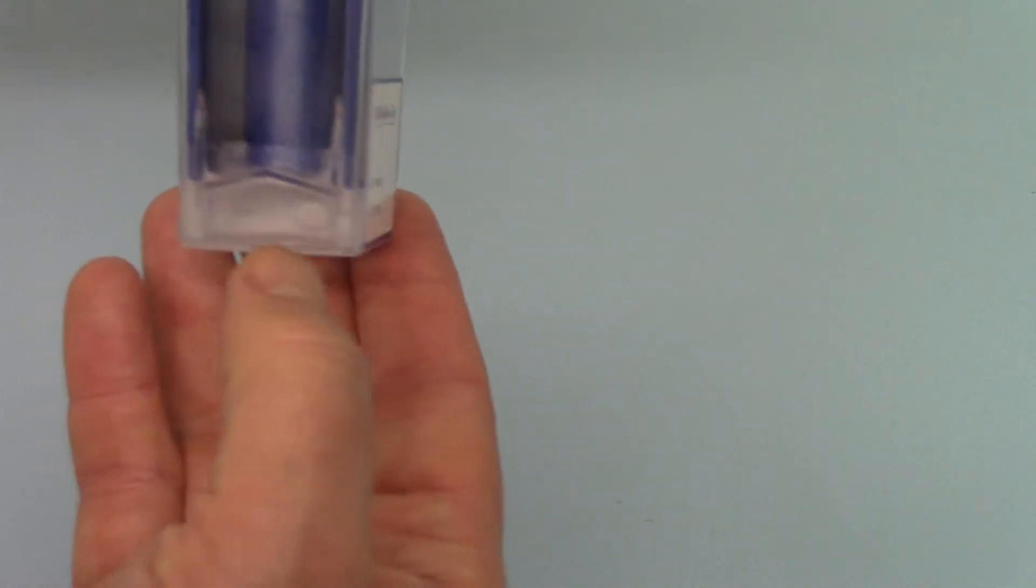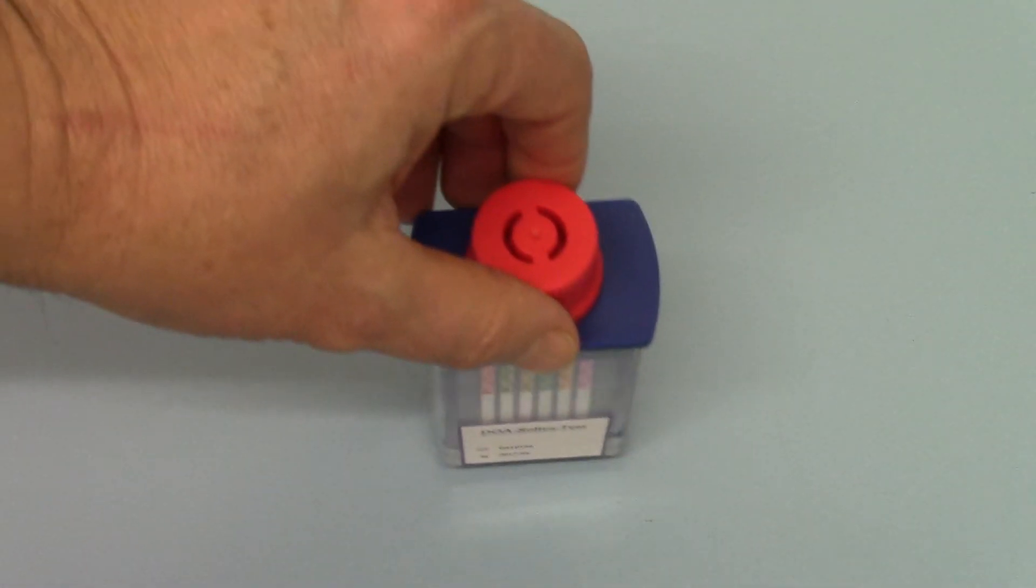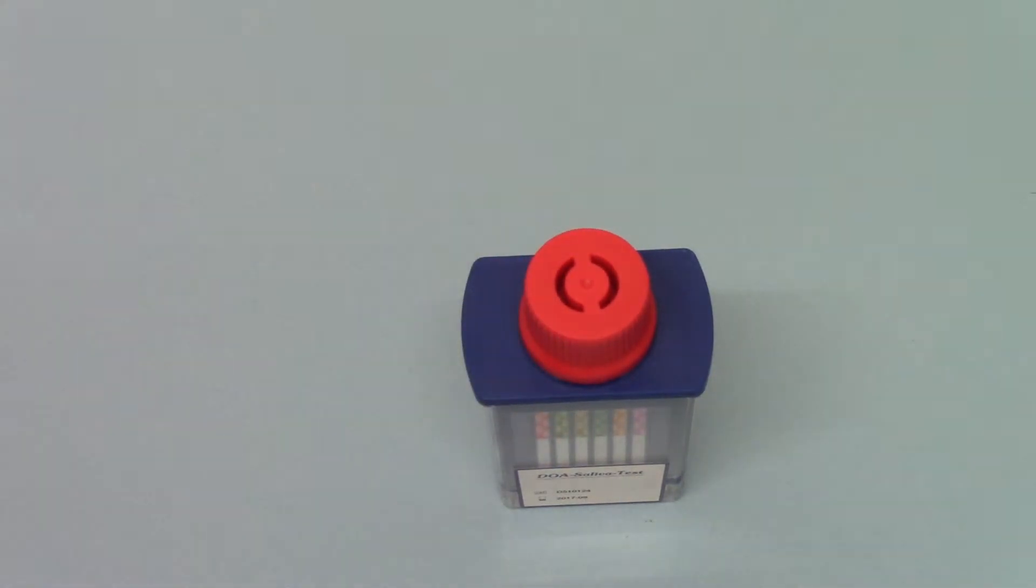The test should then be placed in a vertical position and left to run. Once you assemble the test and discharge the sponge, start your timer. You're looking to read the results between five and ten minutes. Within a couple of minutes, you'll see the pink dye starting to run.